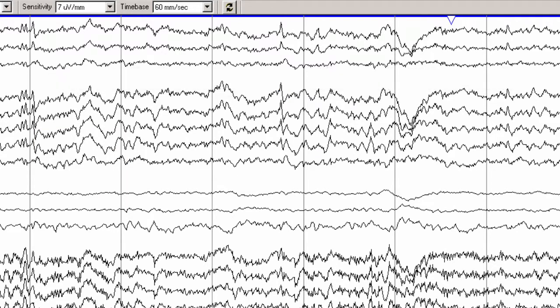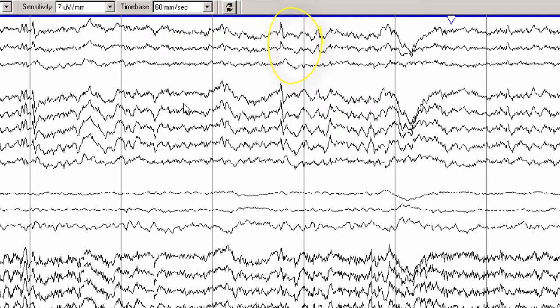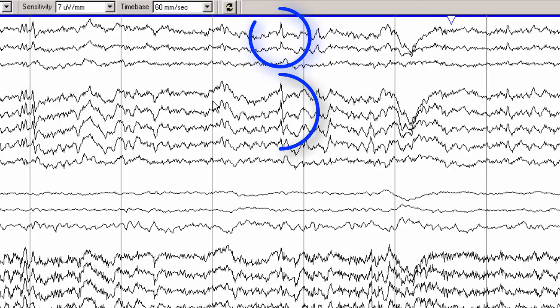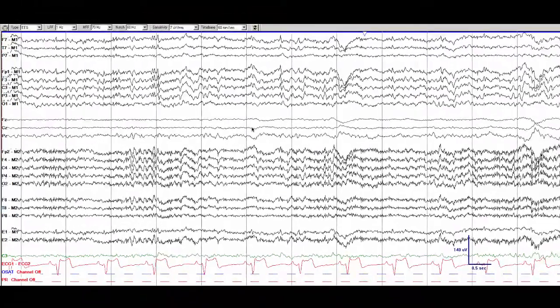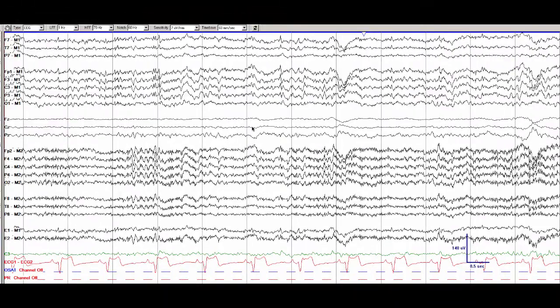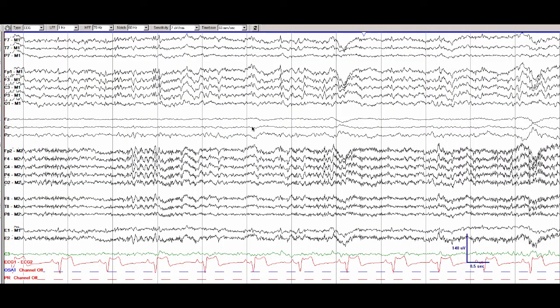A few things to note about this small sharp spike is that it does have a subtle low voltage slow wave following the sharp waveform. Also it has a broad field that extends throughout the frontal and temporal regions. It does not disrupt the background like a true epileptiform discharge and it is occurring during stage 2 sleep.